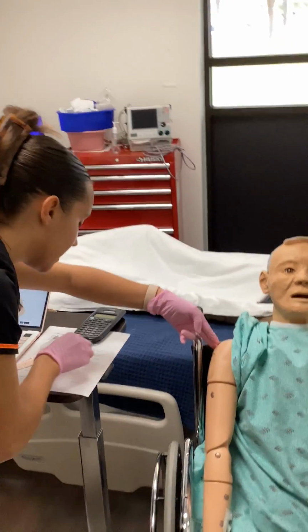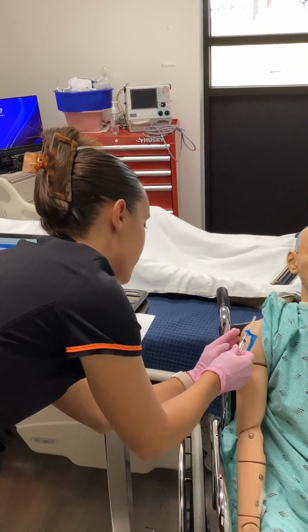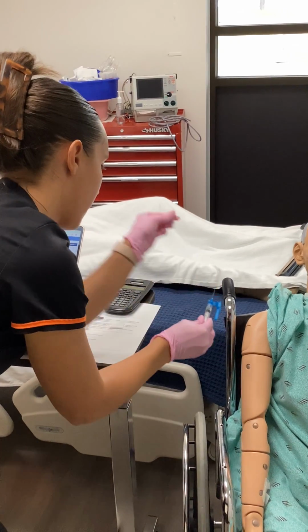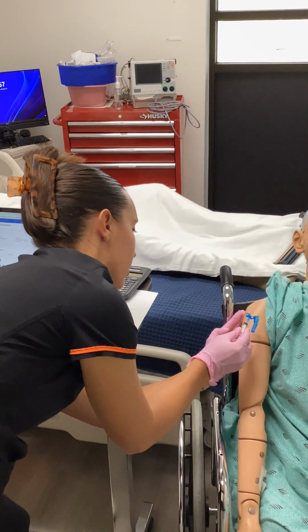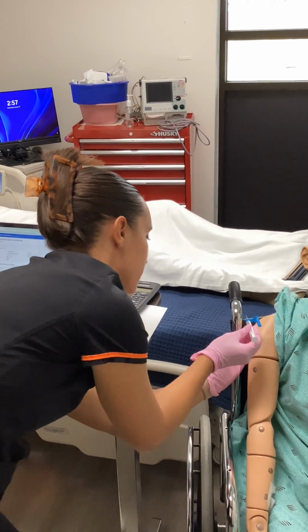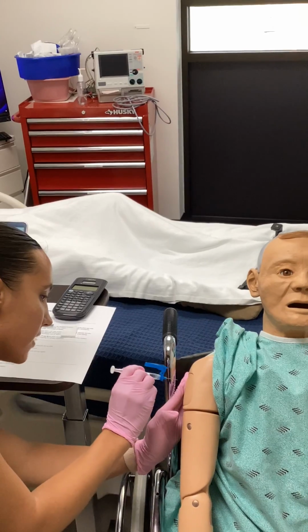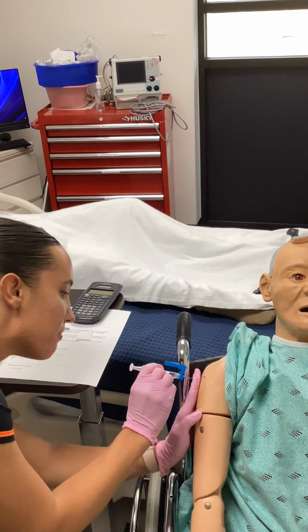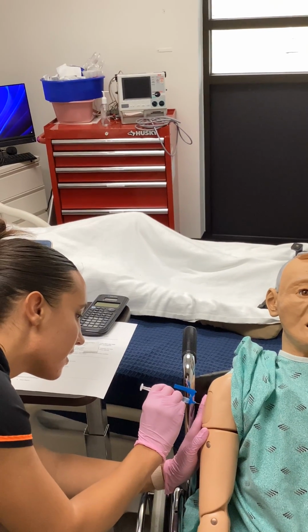Okay, I'm going to be doing the Z-track method. So I'm going to be pulling the skin over. I'm going to take this cap off. I'm going to be pulling the skin over. And I want to be giving this at a 90 degree. So, and we're going to dart this in. So I'm pulling the skin over, and I'm going to push this in.